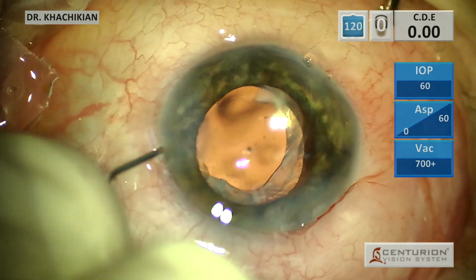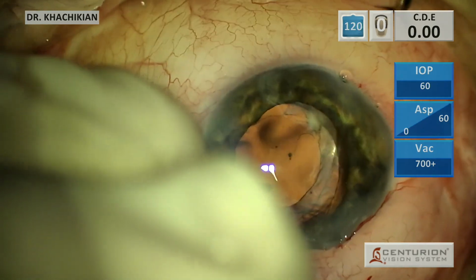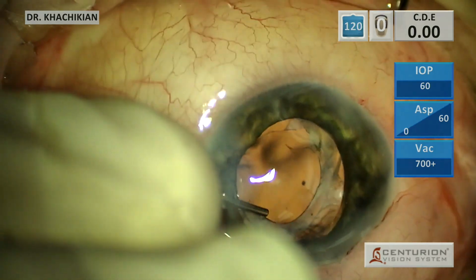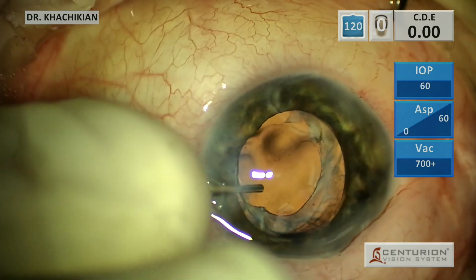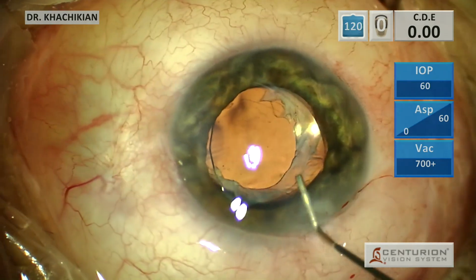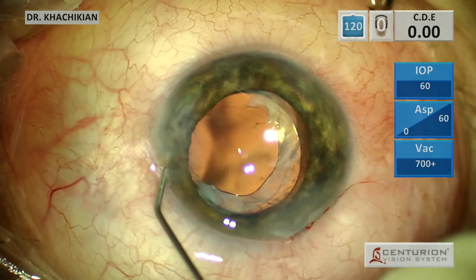And that's our case. So I hope you folks enjoyed this one. I thought it was interesting given the severity of the scarring. But this patient really did great, was very happy afterwards. Still, I think, needs to have a YAG, which we'll do in a few months once things have settled down. But it really came out well.